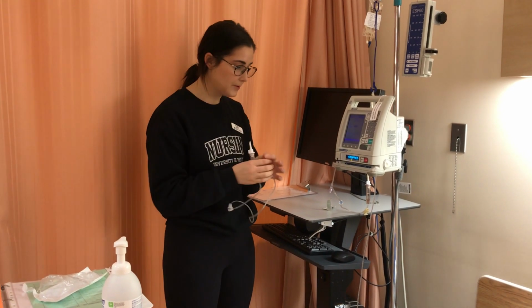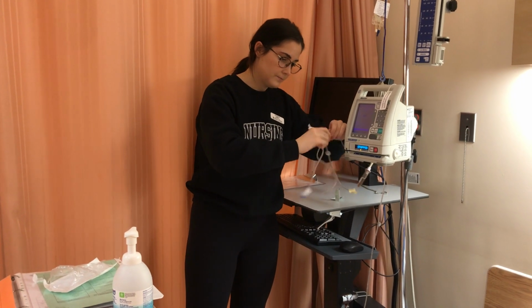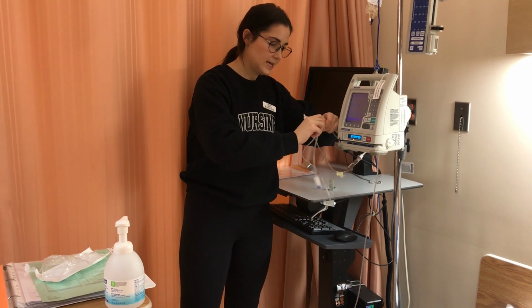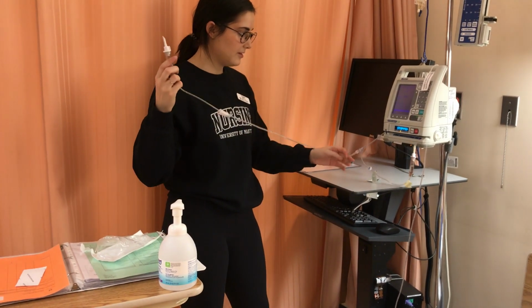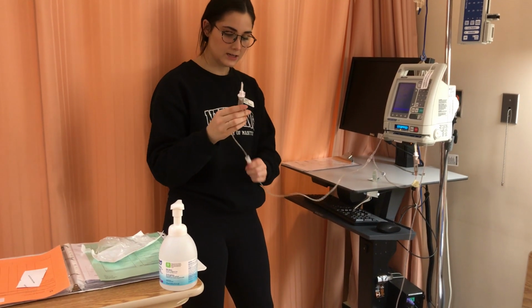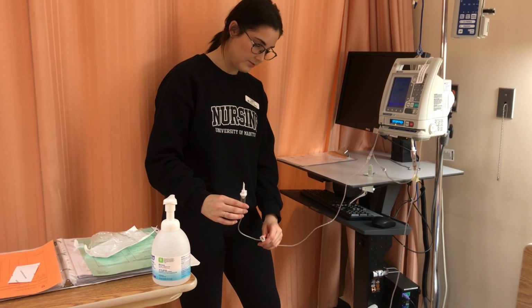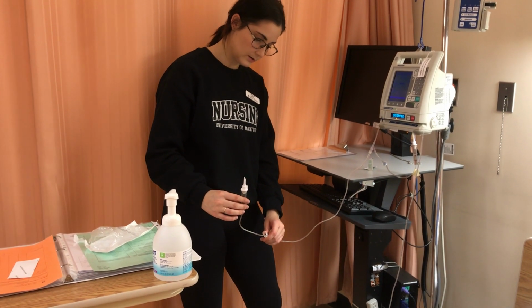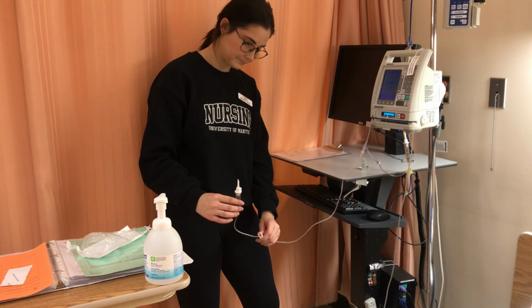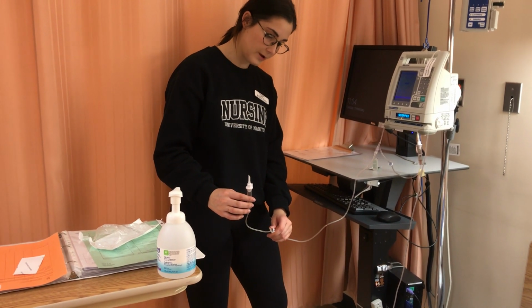This would have a cap on it. I would remove the cap while maintaining sterility. I would put it on and make it tight. And make sure the clamp is closed. So now that this is on, I'm going to prime it slowly. So I'm going to lower it below the level of the IV and watch the bubbles slowly come out. And I'm going to fill the chamber about halfway.